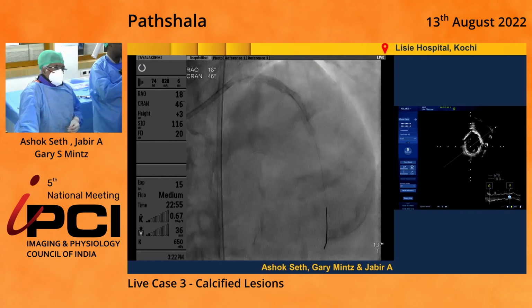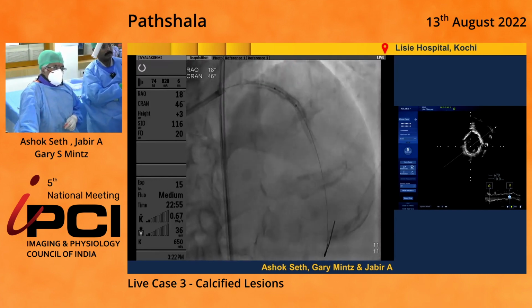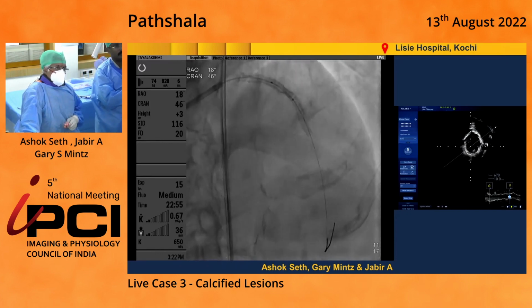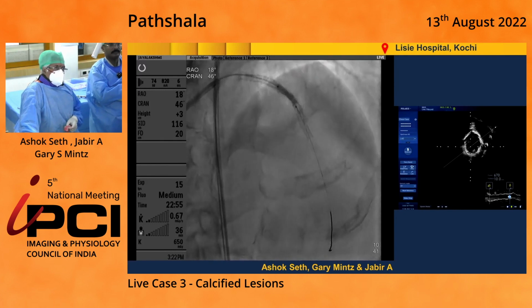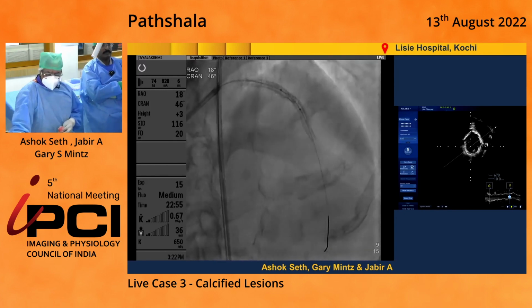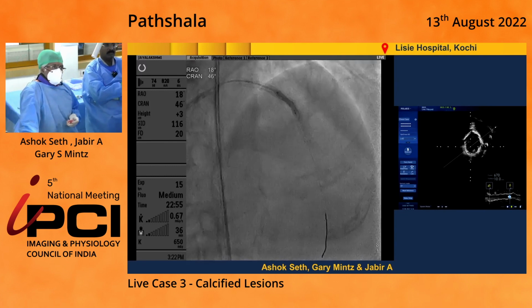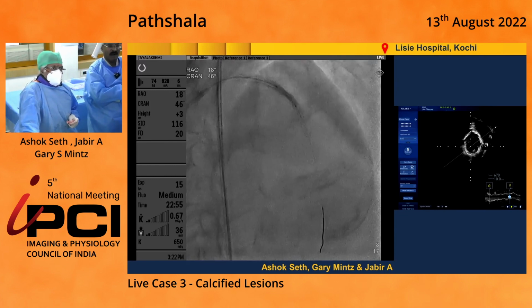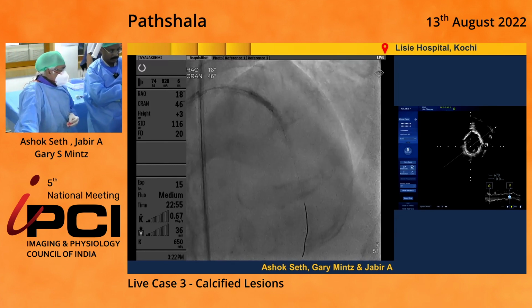So we've moved the balloon backwards, forwards, and we can go minus. You can see that that's eccentrically placed. That's more at the distal emitter. This is more at the proximal emitter. But we actually had the emitters always at the point of the maximum overlap and the maximum under expansion. Did we make a difference? Did we see an expansion of this balloon completely? No, we did not.